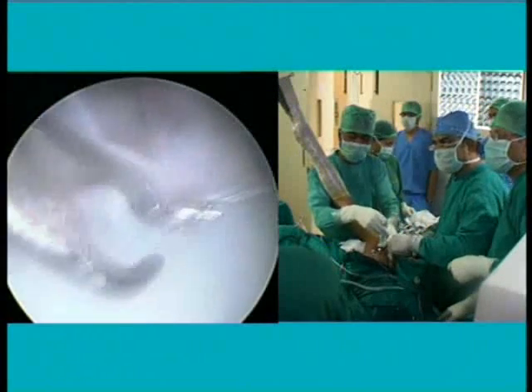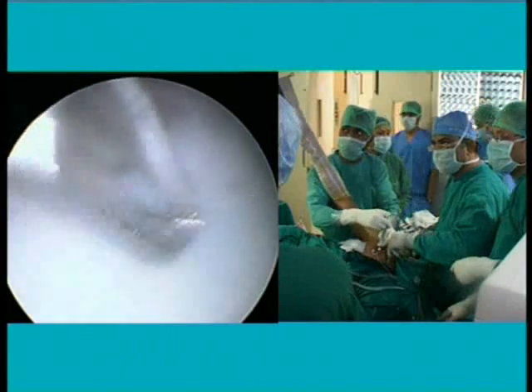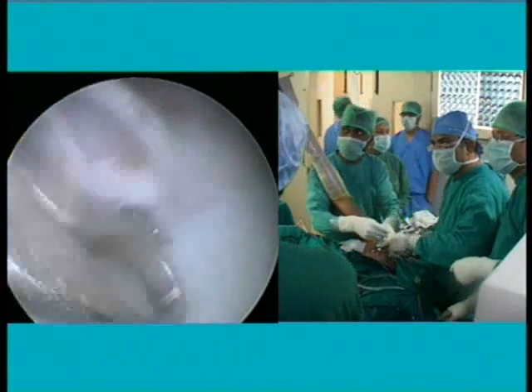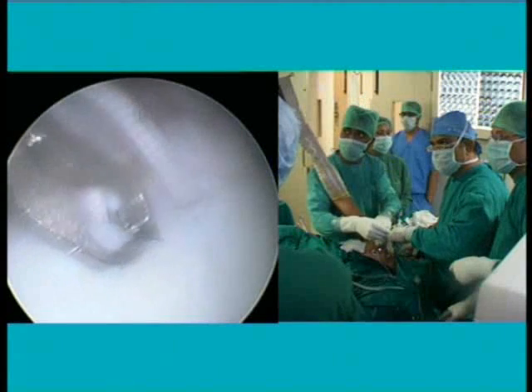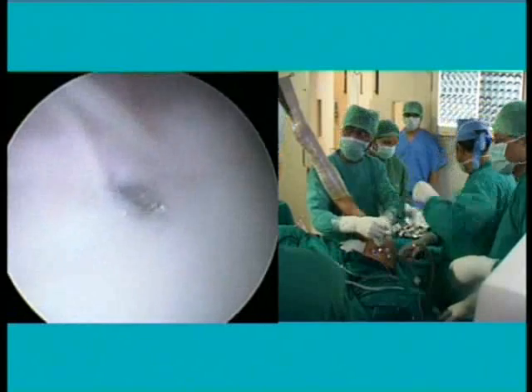The AC joint jig is this. So this is the passport cannula. These are very handy. This is a variable angle AC joint jig available. This is an Arthrex jig. This tip is placed in the portal.